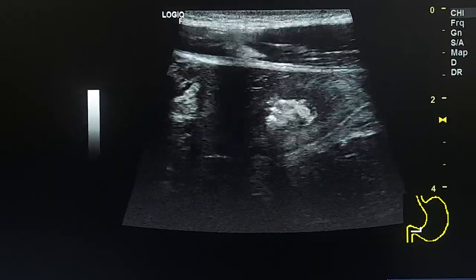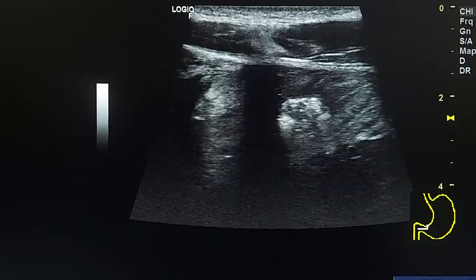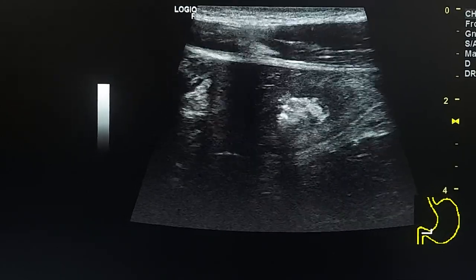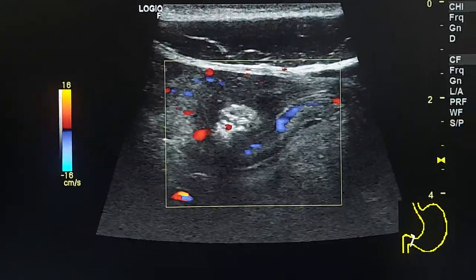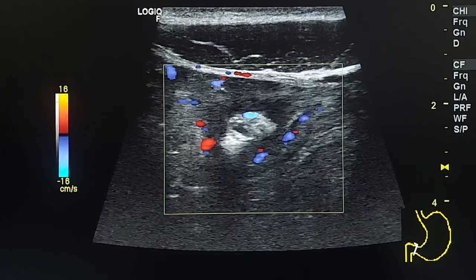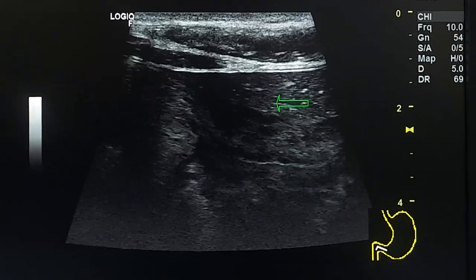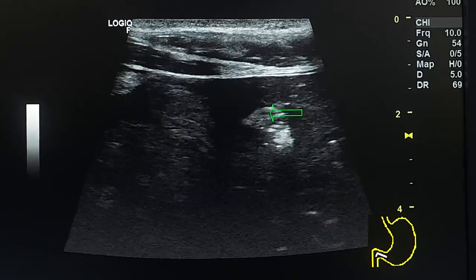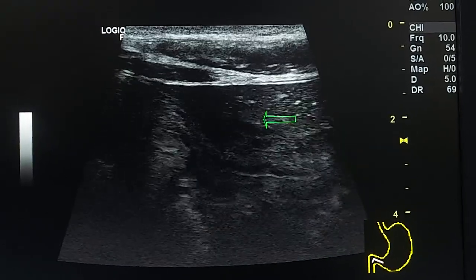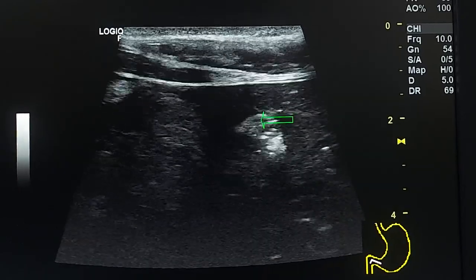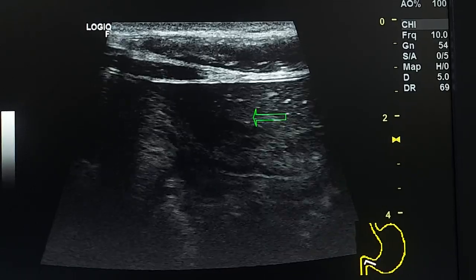It was confirmed after the patient drank water and in multiple different positions. This is another view. Here we see that this mural defect is in the subserosol area of the wall.